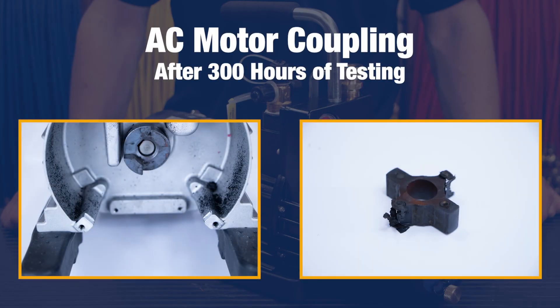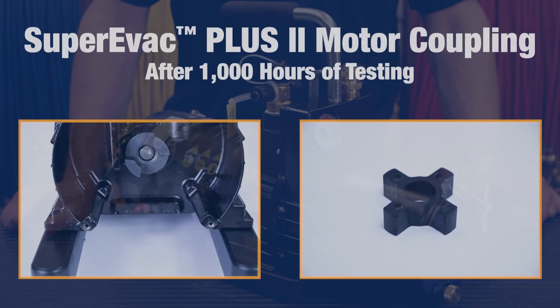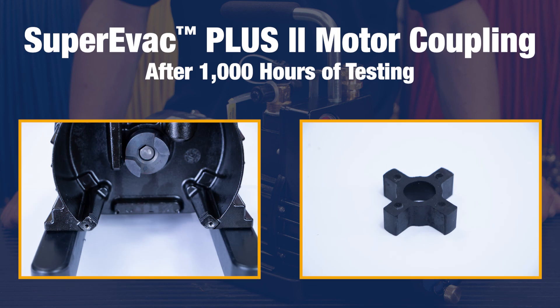Here we have an example of what the AC coupling looked like after only 300 hours of running. The coupling spider has completely shredded and the coupling is running metal on metal. The pump runs loud and rattles since the coupling no longer has its damper, and the bearing and pump life is negatively impacted. Here we have the SuperEvac Plus II pump which was run through the same test. This coupling has had over a thousand hours of testing and is still intact, not showing any signs of wear.